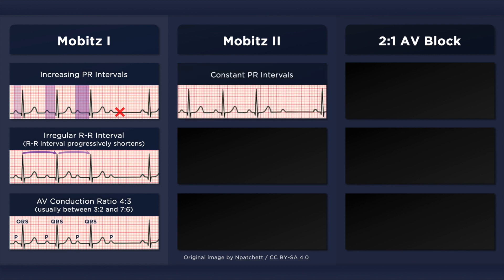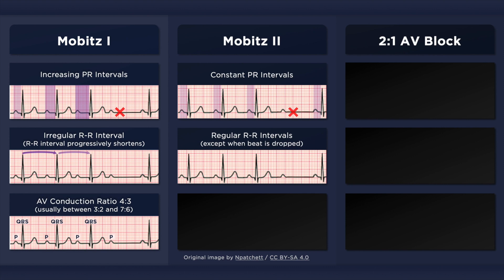Type 2 second degree AV block is characterized by constant PR intervals and an intermittent failure of the atrial impulse to conduct to the ventricles. Unlike in Mobitz 1, the PR intervals are consistent between all conducted beats. As well, the RR intervals are constant and the rhythm is regular until a beat is dropped. This can be referred to as a pattern to regularity.